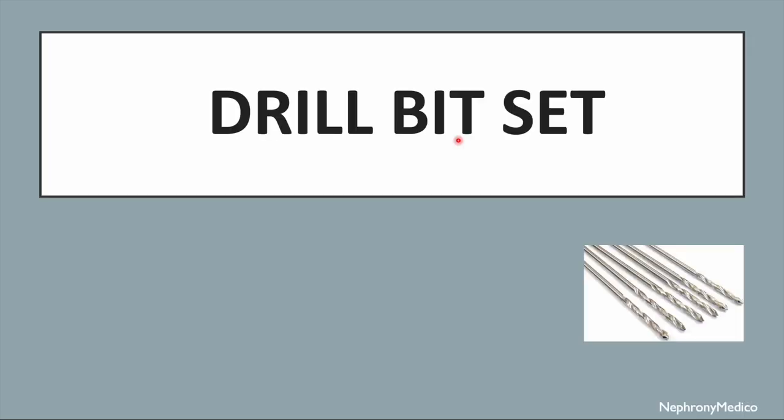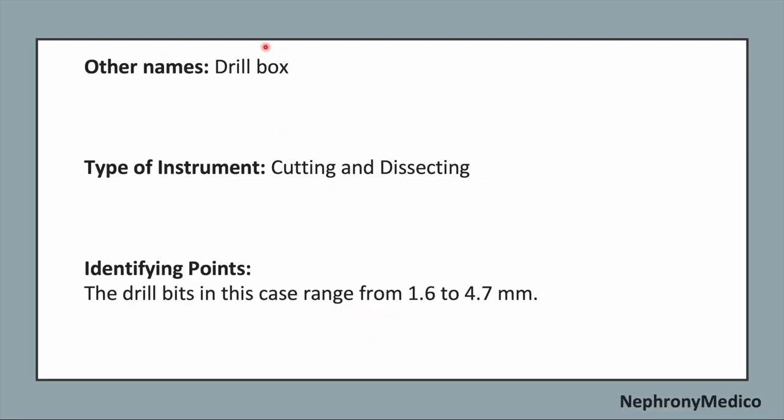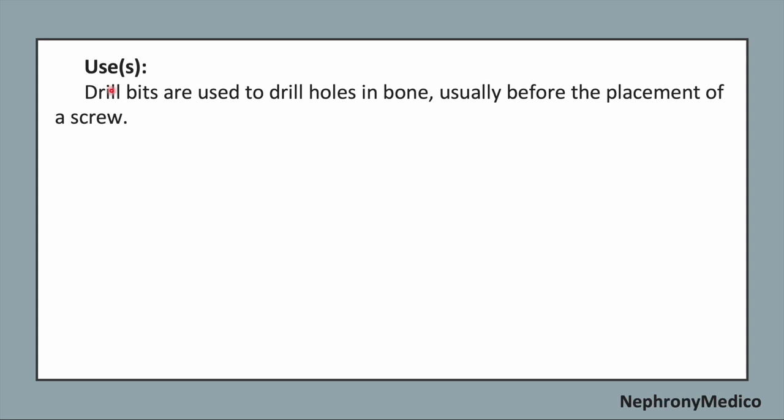Talk about drill bit set. This is a picture showing drill bit set. The other name is drill box. It is a cutting and dissecting type of instrument. Now, identifying points. The drill bits in this case range from 1.6 to 4.7 millimeter. Use. The drill bits are used to drill holes in the bone, usually before the placement of the screw.